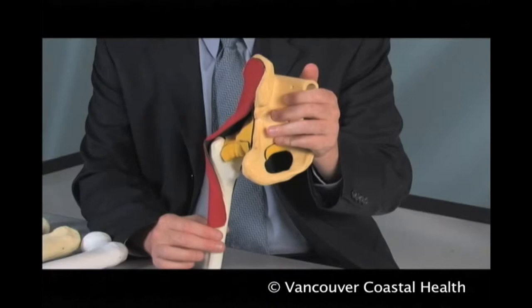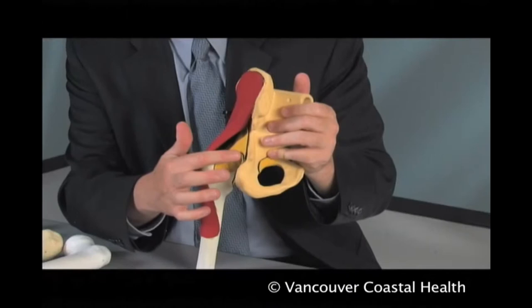This model of the hip joint demonstrates the bones of the pelvis and the femur, with material representing the abductors of the hip as well as the anterior and posterior hip capsule.